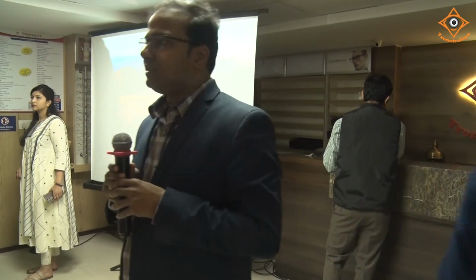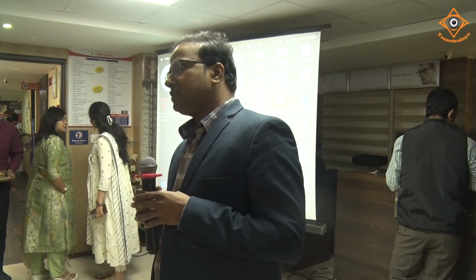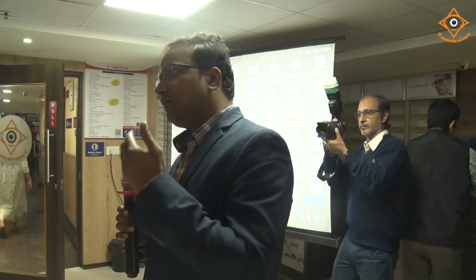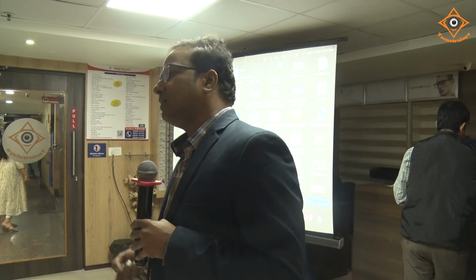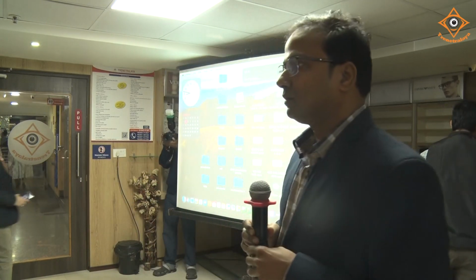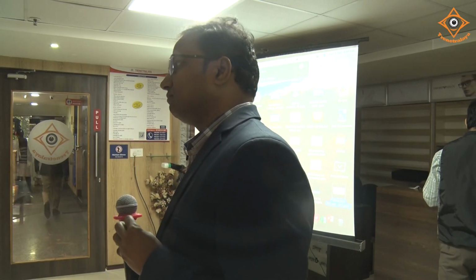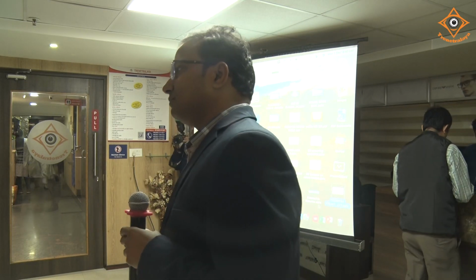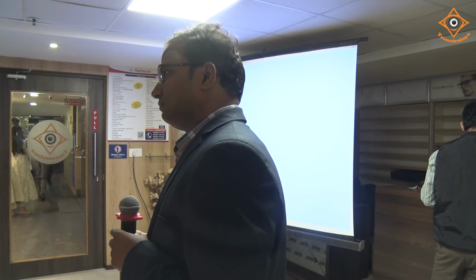If there is no cornea-iris touch and no choroidals, so there is no threat, we can observe it. If there is no touch, then only we can observe. If touch has happened, then we have to intervene. We can take the patient to the OT and primarily inject viscoelastic or an air bubble to form the AC. Usually these cases subside without much problem. Just put a cycloplegic, and if there are no choroidals, there is nothing to worry about. We wait at least 2 weeks for it to settle down.